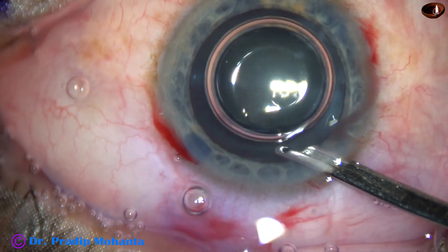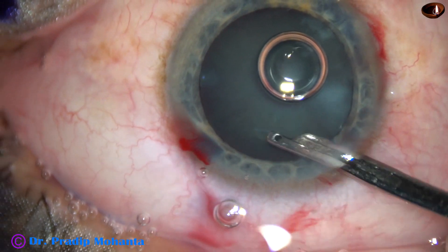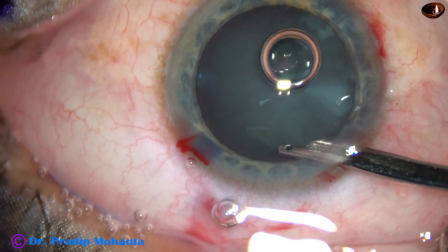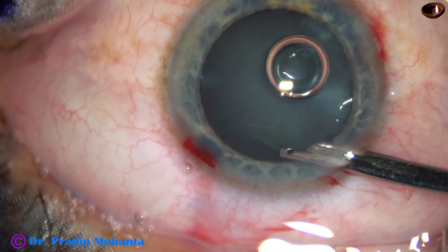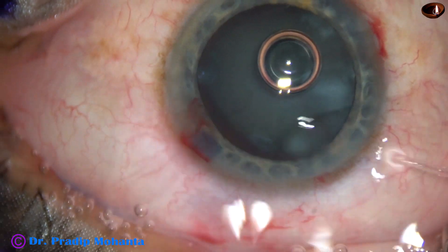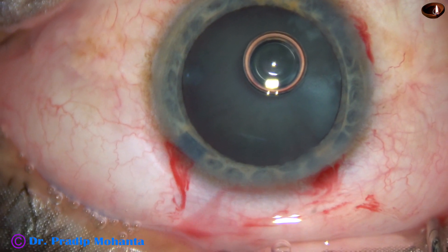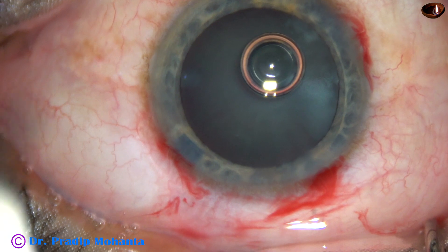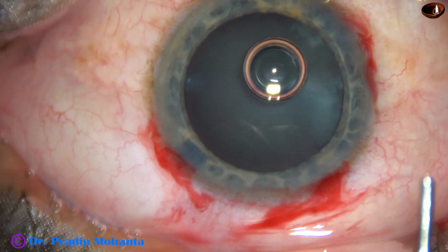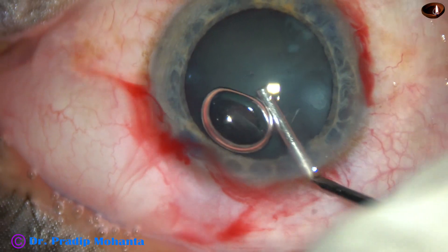See, if we wash the dye out, we can see there is very good staining. This is real time, and we can see this is very good staining in just 7 to 8 seconds. And now, 2% hydroxypropylmethylcellulose is injected into the anterior chamber.